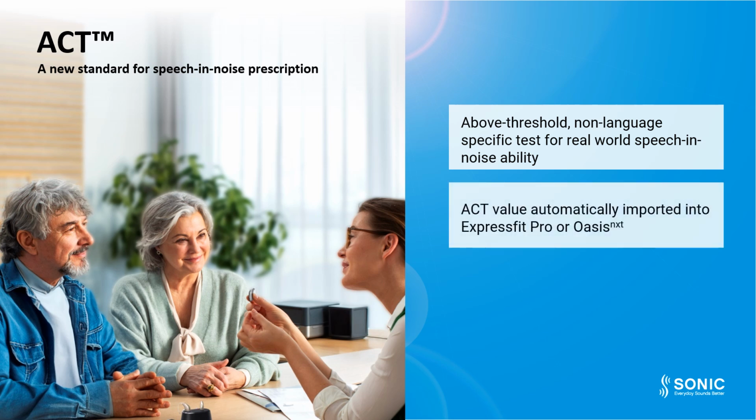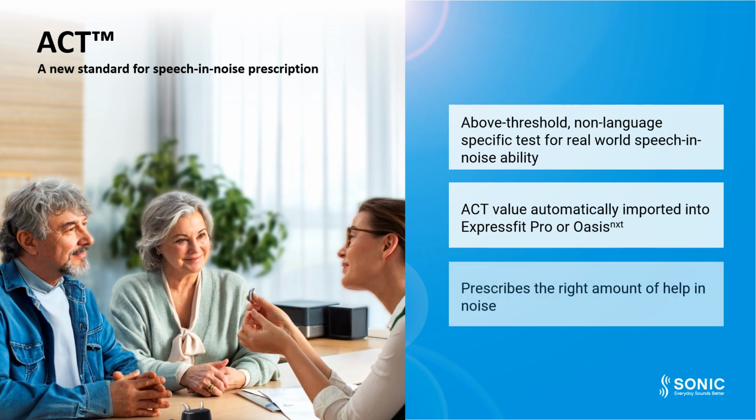After doing the ACT test, it will give us a number, which is called the ACT value, which will then be automatically imported to ExpressFit Pro or Oasis Next from NOAH. The ACT value can then be used to prescribe the right amount of help in noise in the software.